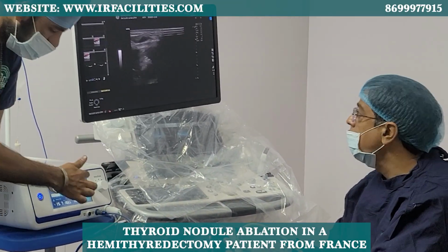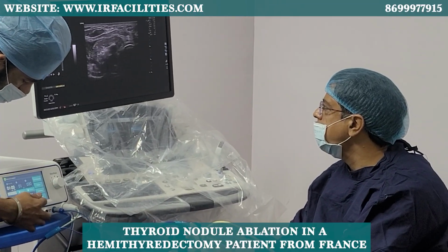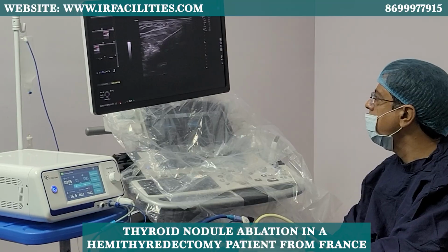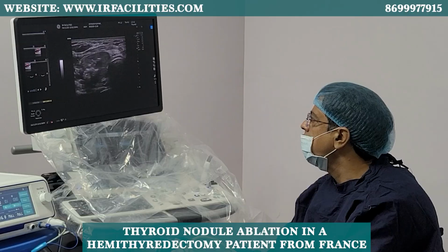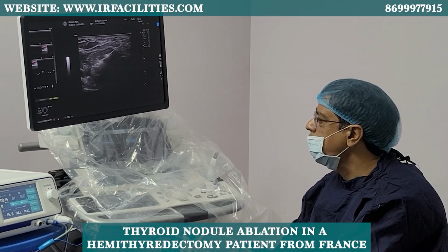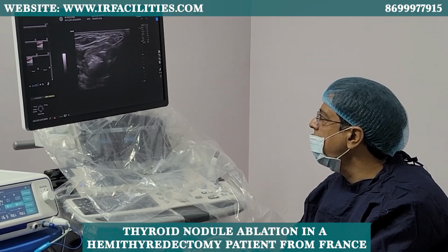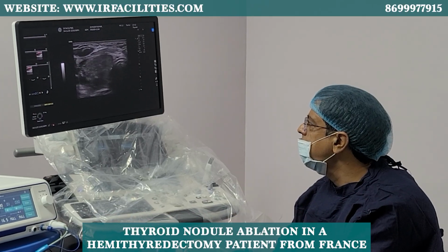So it's just 1 minute laser over, okay? Reset, continuous. Yeah. If you have pain, we can give you some painkillers. Strong one, opioid, to make you sleep. Do you need it? It's on fine for now. It's okay. If you have it, just tell me, okay?